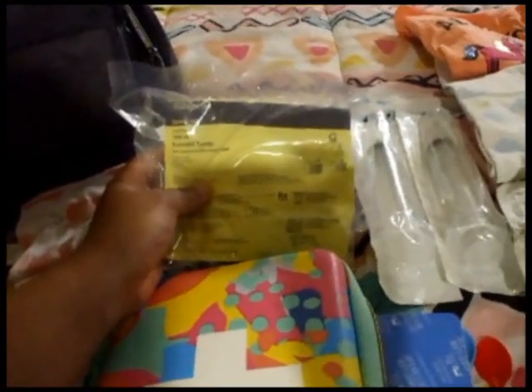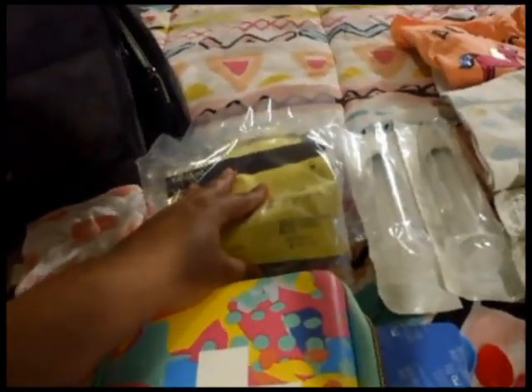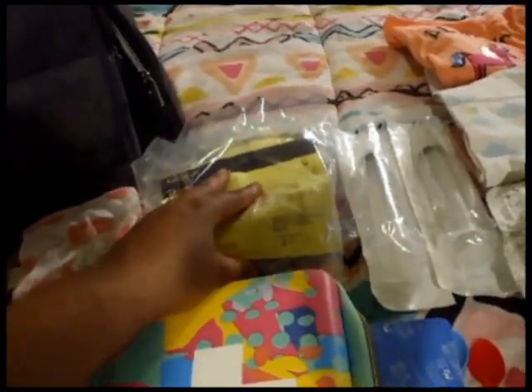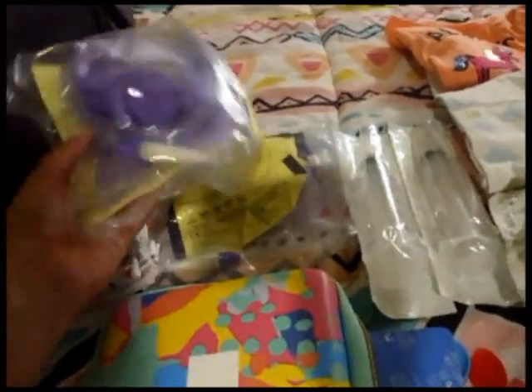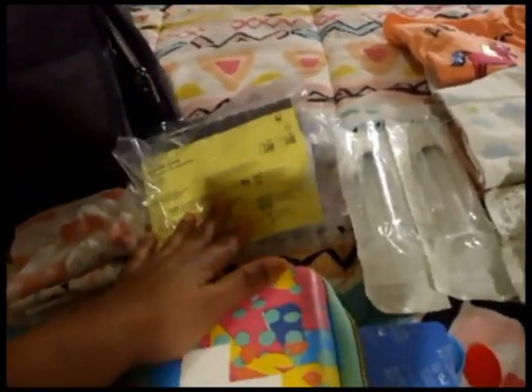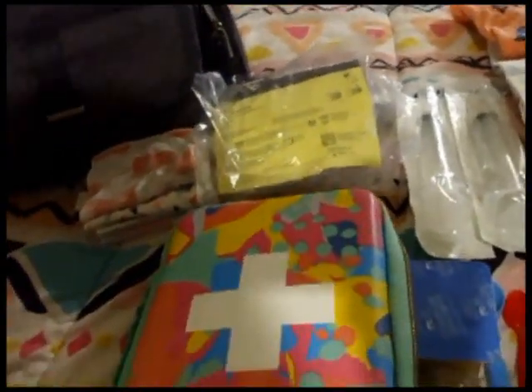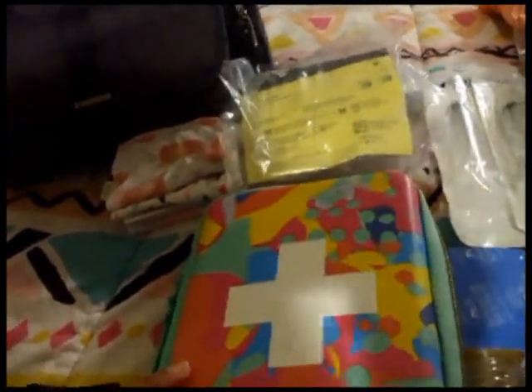She does have a Mickey button, or a G button, which is a feeding tube that goes directly into her stomach. So I do tend to carry her feeding pump around if we're going to be out for longer than an hour or so. And I just pack extra feeding bags. Of course, like I said, if we're out longer, then I'll pack more than 2 bags, just in case one of the bags is faulty or malfunctions.